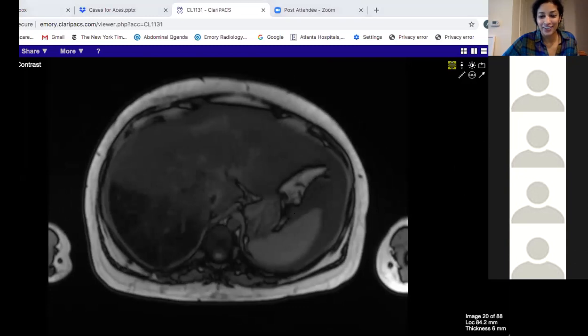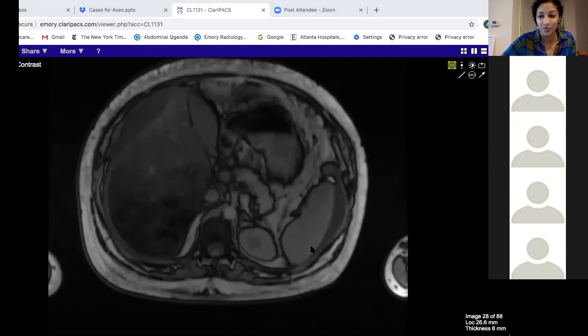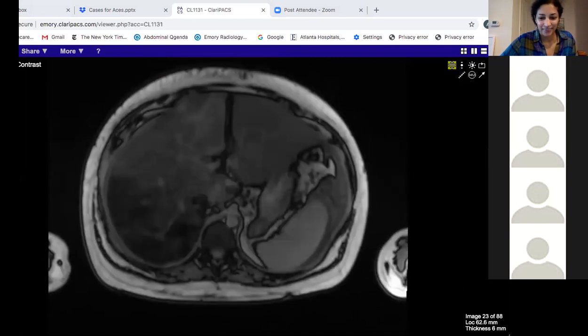And David Fetzer says this is another good case for contrast-enhanced ultrasound. Good, excellent. So David's going to show us some interesting cases from contrast-enhanced ultrasound next Tuesday. So he can show us how he excludes Budd-Chiari if he has one of those cases. Any other comments?